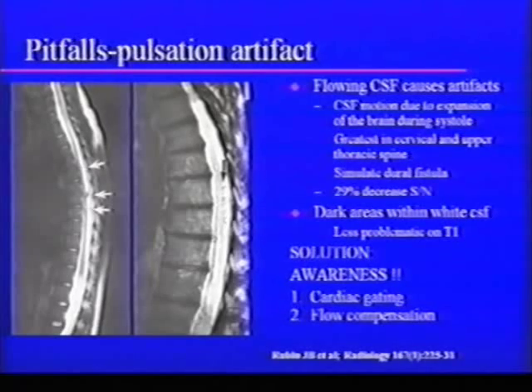Okay? That process can actually cause ischemia to the spinal cord. And when you can diagnose that problem, you can fix somebody immediately. If they have that dural fistula, we can diagnose it and fix it. Now, what does the dural fistula look like? What it looks like on MR is areas where you don't get signal back, little black spots in the fluid around the spinal cord, okay? And that should make sense because what happens is the veins all dilate up.